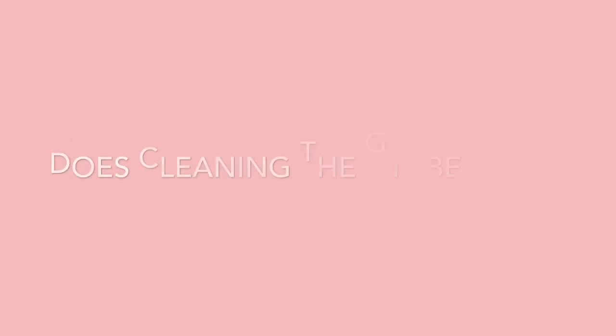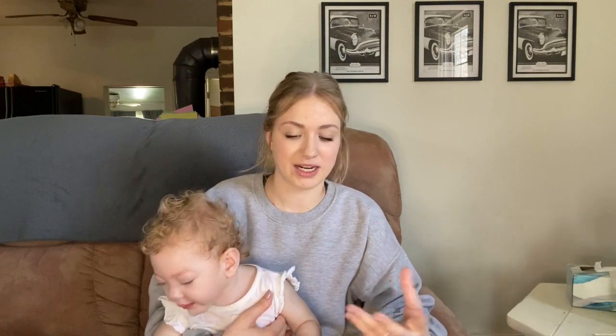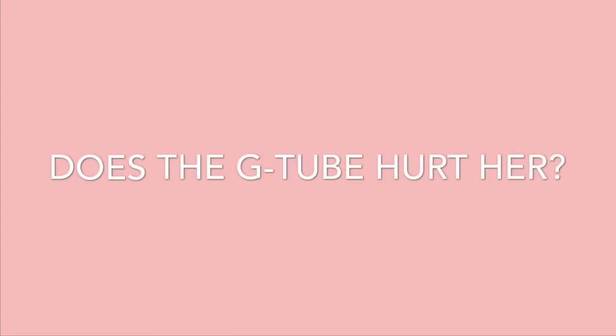That's how you clean the site. One comment I got from a previous video was: does it burn her? It doesn't burn her — if I was holding her she wouldn't even be crying. Think of it like a piercing: once it's healed, you can put things in and out and you don't really notice it. That's how a G-tube site is — at least that's how a nurse described it to me to help me calm down, because the thought of it just did not sit right with me.